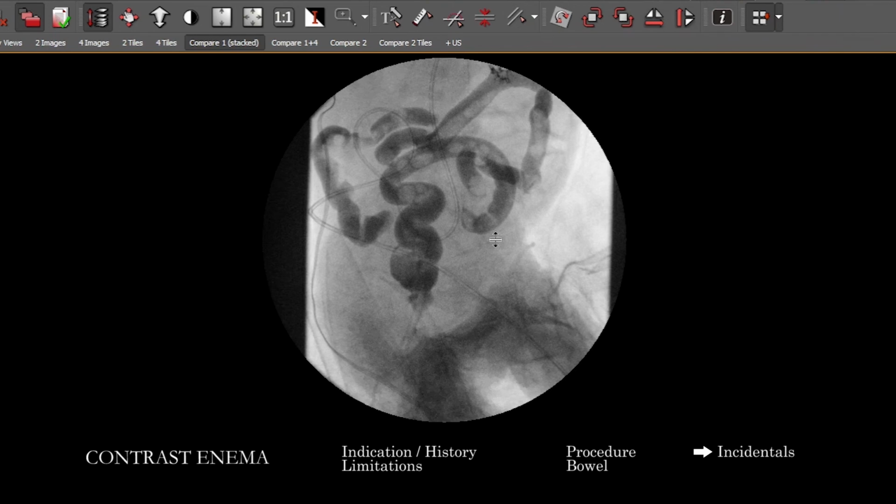And it's important to keep in mind that with this sort of exam, the contrast or barium enema, you can't really completely exclude Hirschsprung's. Though if you do see these findings, it suggests a diagnosis. The gold standard, at least at the time of this video being made, is, again, biopsy.